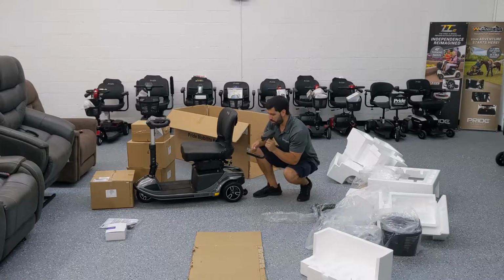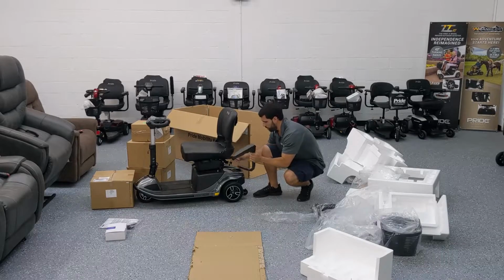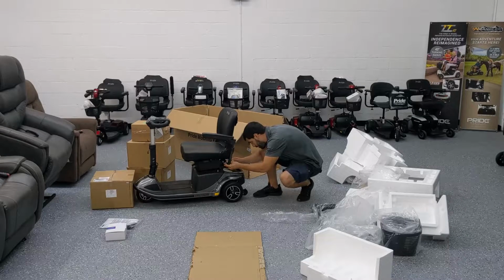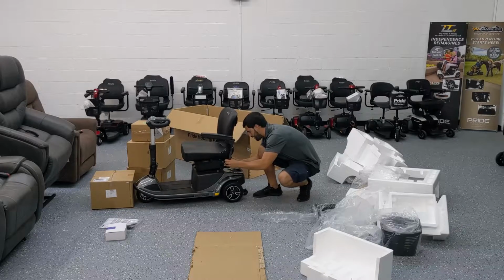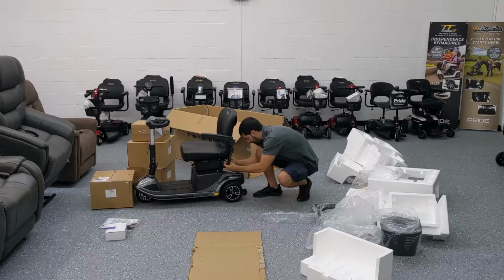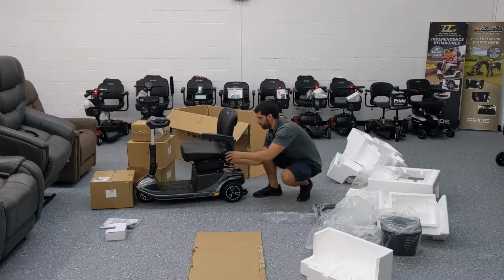Basically one pin goes all the way through, and then this pinches it into place to lock it. There are two settings, so you can choose the width of your seat and armrest. You have two different options there, about a half inch of space between each slot. So you can have it here, or you can slide it out and have it there, giving you the option to play with the width until you find the perfect width for your needs.